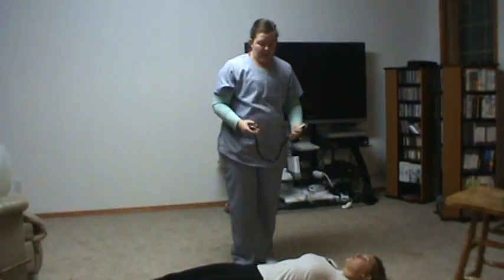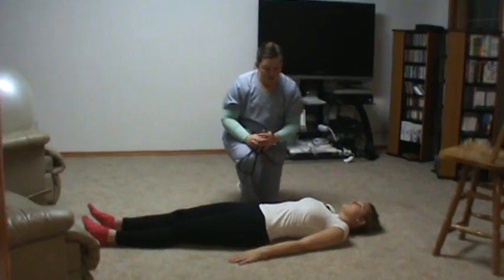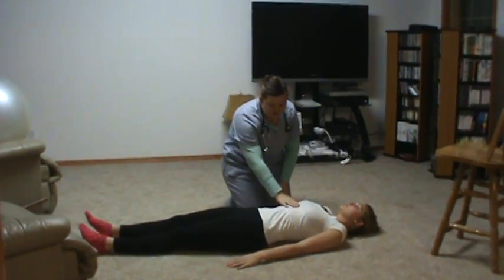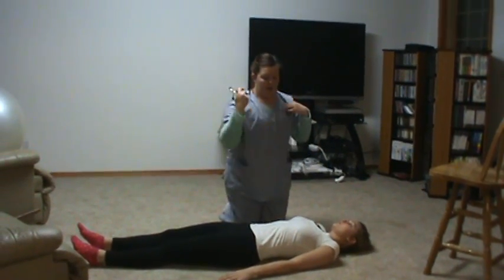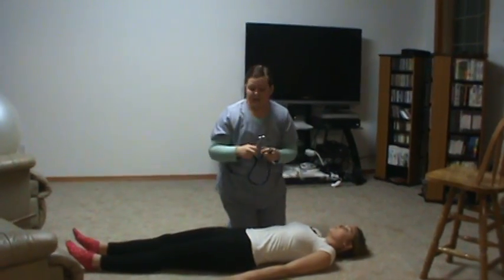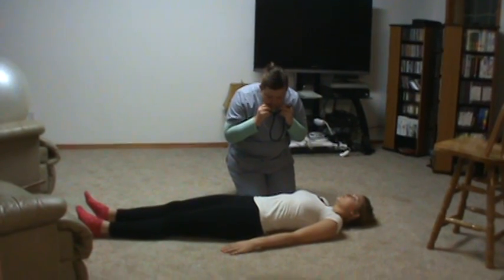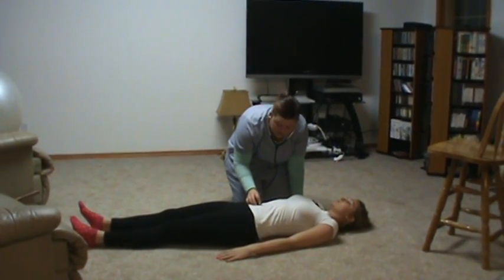So now I'm looking to see she is symmetrical, and it's flat. It's not concave or anything, although you can see her ribs. First, I'm going to assess her bowel sounds before I touch, because it can produce bowel sounds when I start messing with her abdomen. So I'm going to listen in all 4 quadrants.